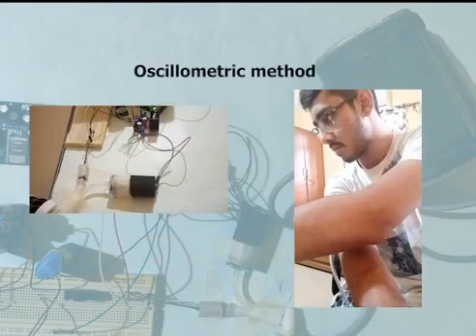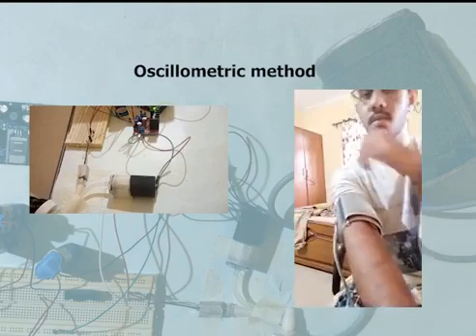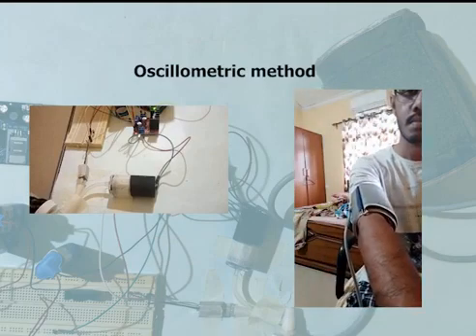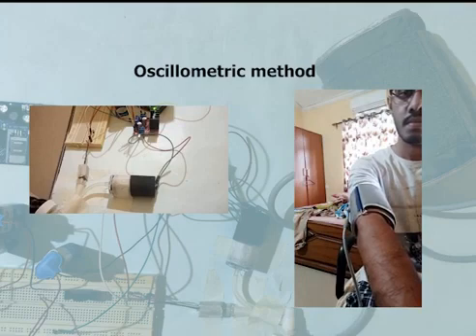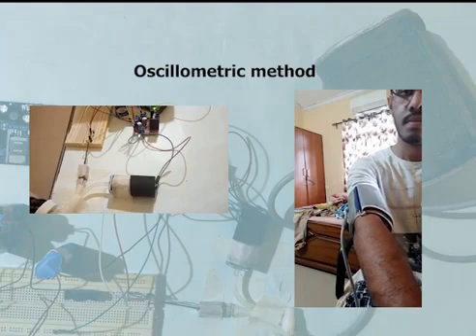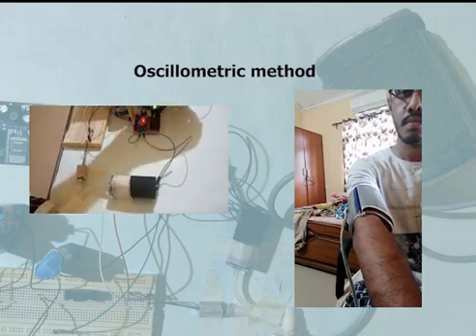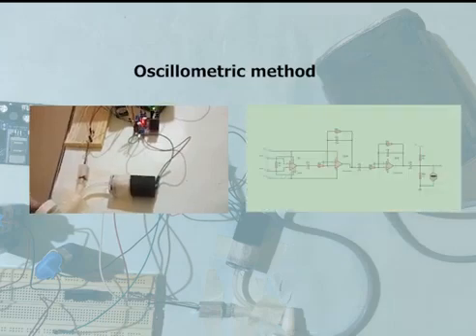Our design uses oscillometric method to measure the blood pressure. In the oscillometric method, we make use of a cuff that is inflated by an air pump, and then the pressure is sensed by an air pressure sensor. We use the MPX 2050 GP. We have also designed an amplifier and filter circuit which was simulated on Proteus.